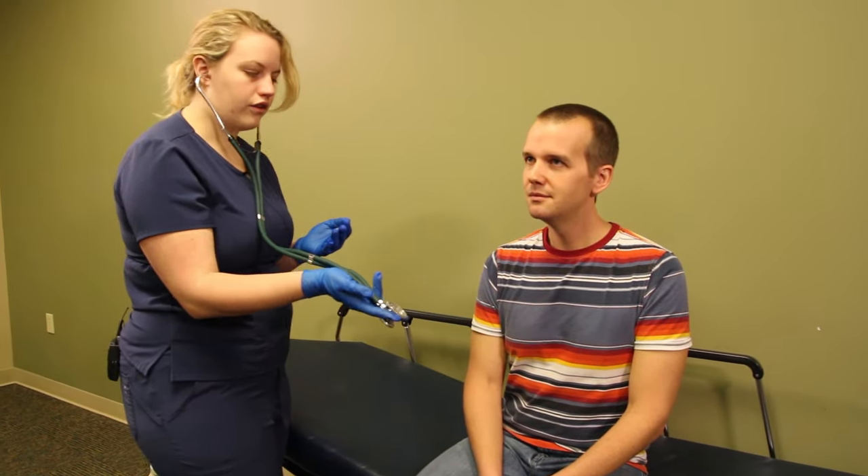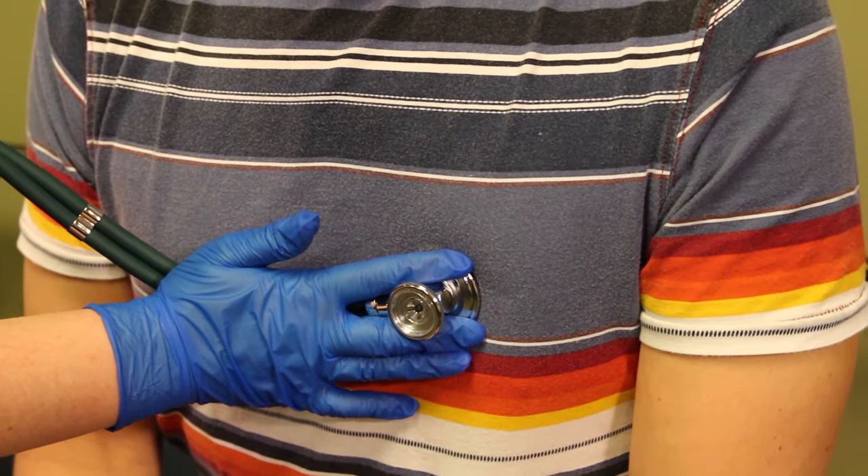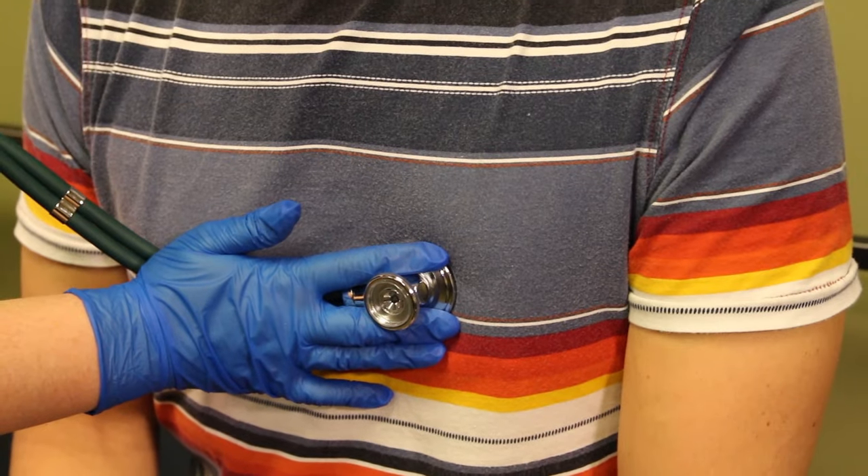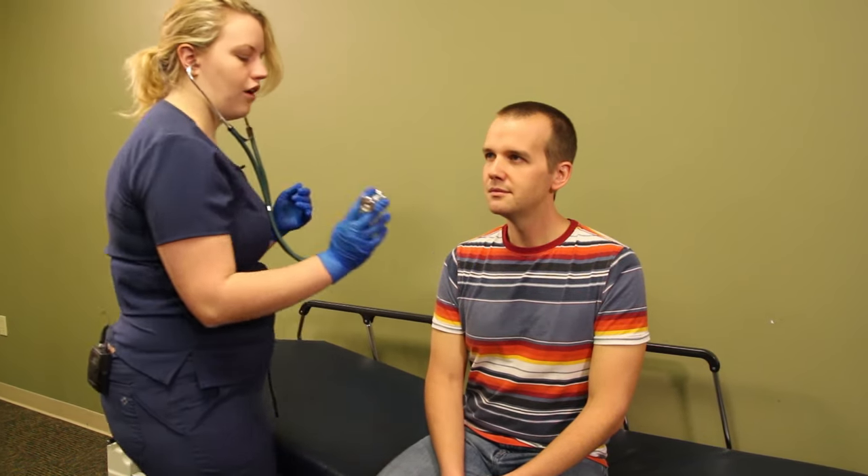Now, listening to the heart, we are going to listen right here — just like where you would place your hand for saying the Pledge of Allegiance. Our patient has both normal breath sounds and a normal heart sound.